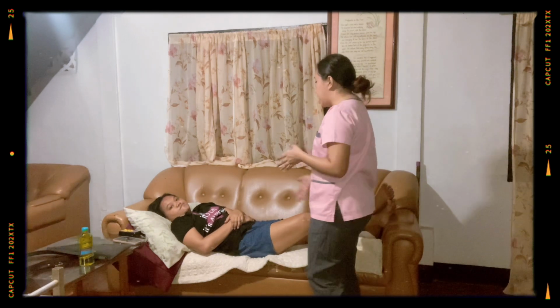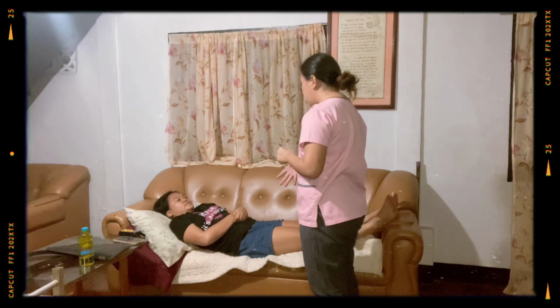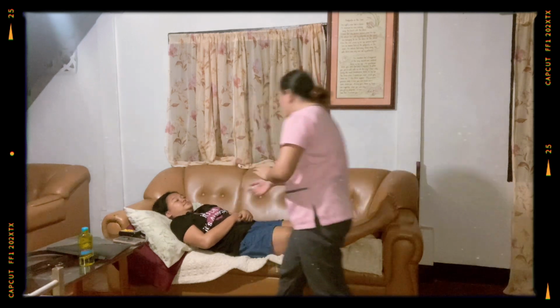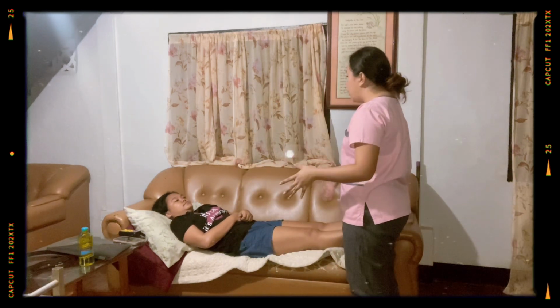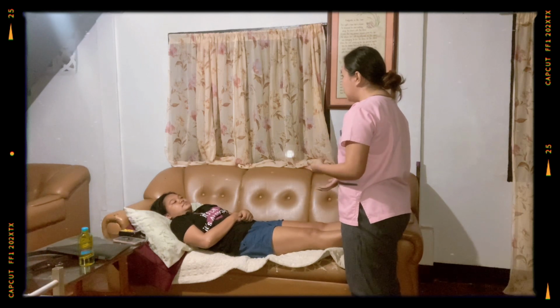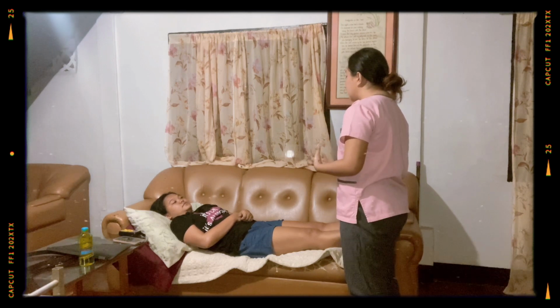So good day, ma'am. I am Myra Justin Bitinor, your nurse for today. What's your name, ma'am? What is your birthday, ma'am? So today, ma'am, we are going to walk using a cane, ma'am. Can you do it? So if you feel any dizziness or weakness, report it immediately to me, ma'am, okay?